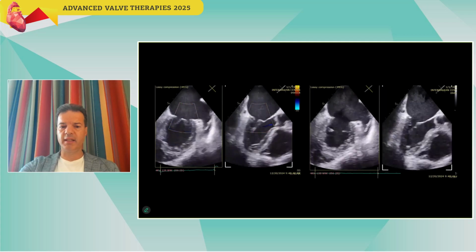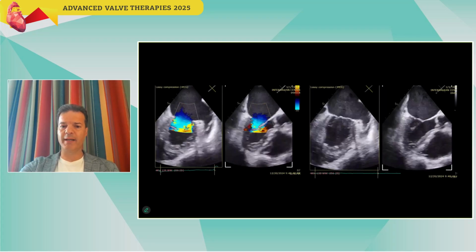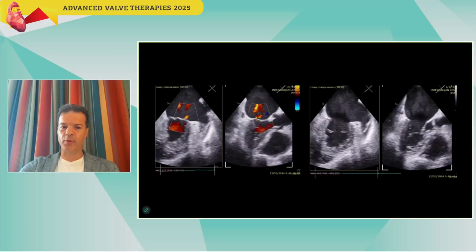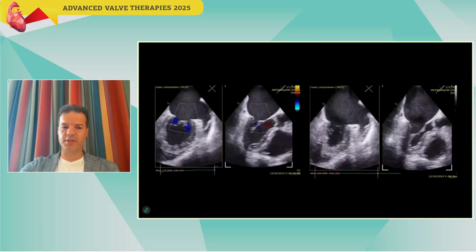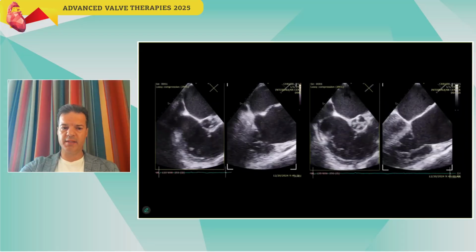So this is the TEE. You can see there's an atrial component that was discussed earlier on the mitral. You know, it looks like a prolapse, but it's not a prolapse. There's this whiff of central MR, and this is the tricuspid.